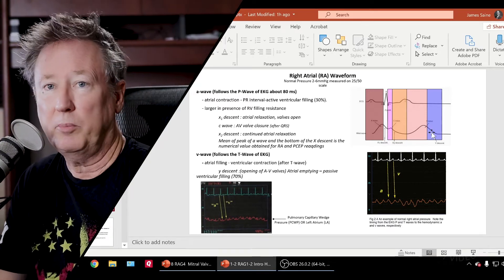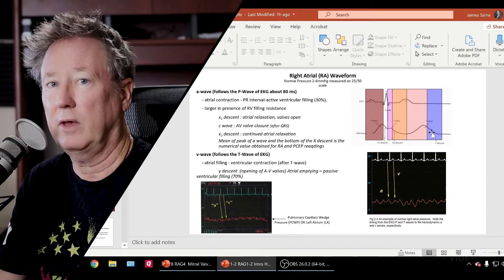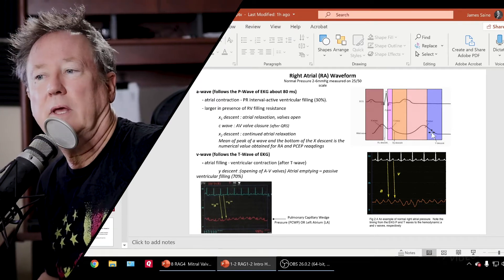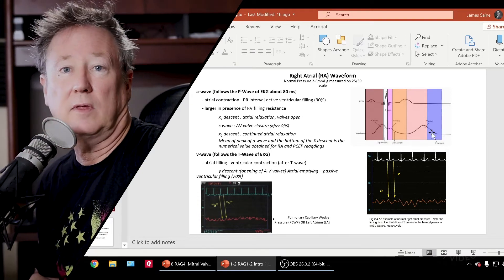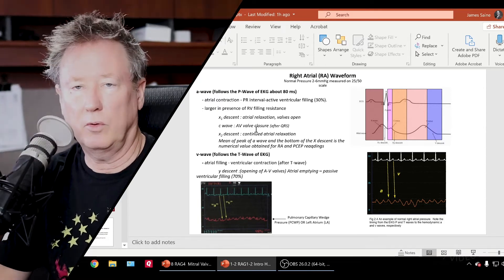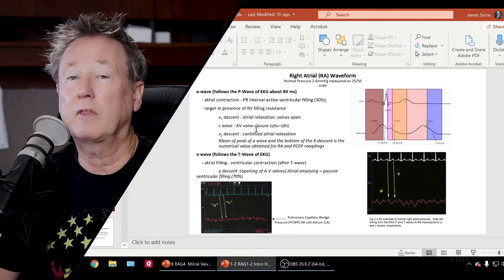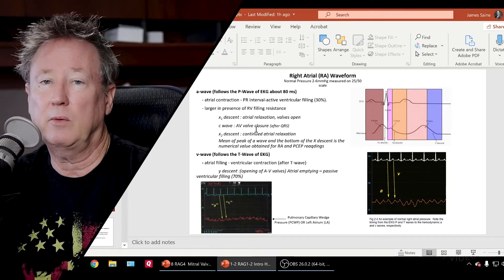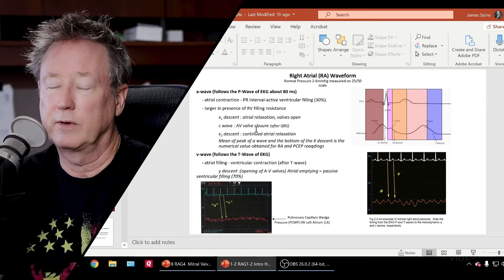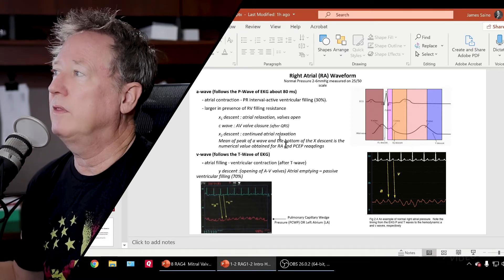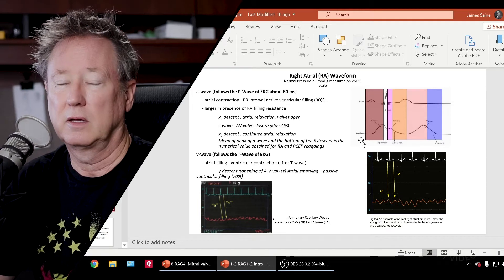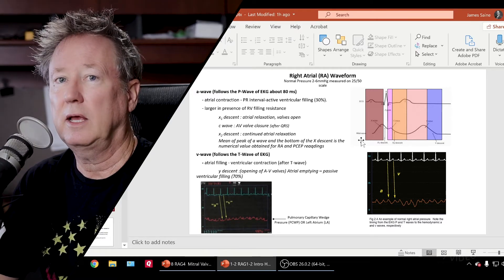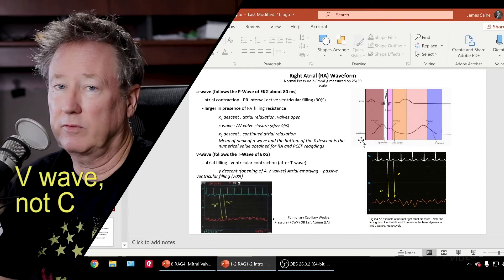Some books refer to the Y descent as the opening of the atrial ventricular valves; some refer to the peak of the V wave as where they open. To determine what's the A wave and what's the V wave when looking at waveforms, a right atrial, left atrial, and wedge pressure all have an A wave and a V wave — though the C wave is often not visible. They all have an A wave if you have atrial contraction; if you're in atrial fib or atrial flutter, you don't have an A wave. To read this correctly, you need to see an EKG alongside the atrial pressure waveform, or an LV pressure alongside the atrial waveform, because the A wave looks very much like the V wave.